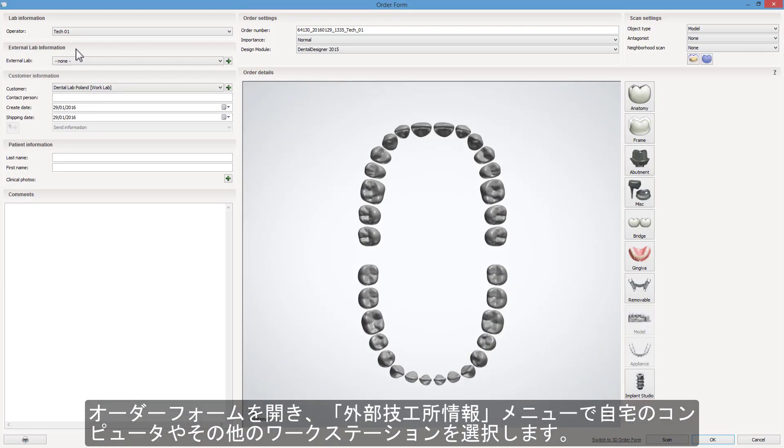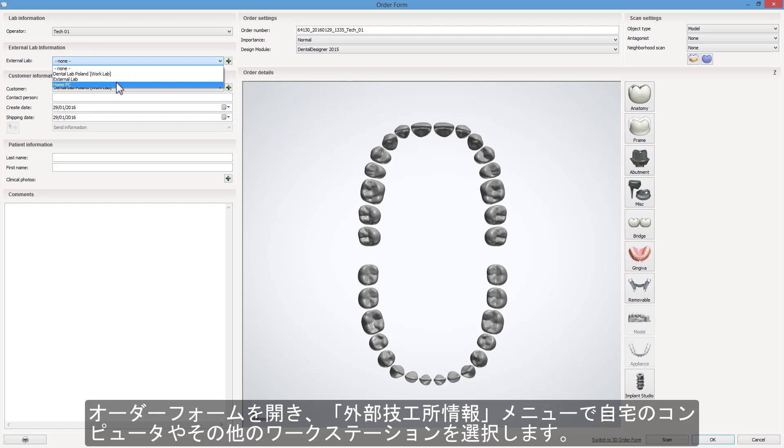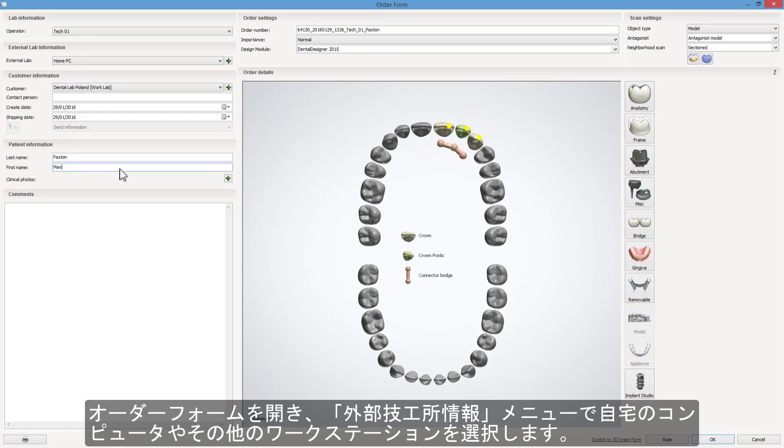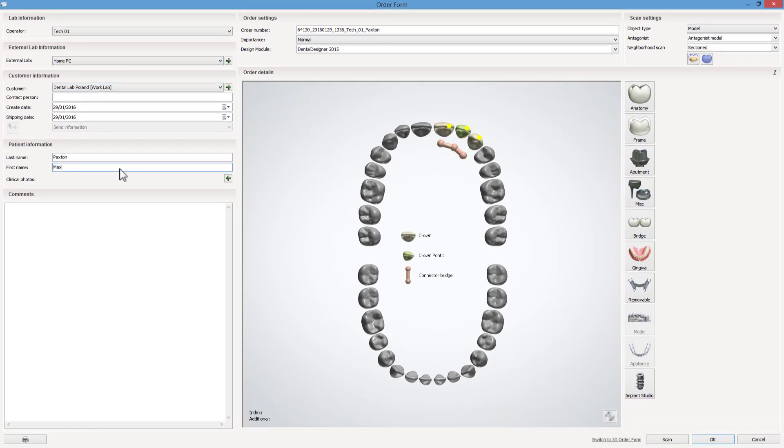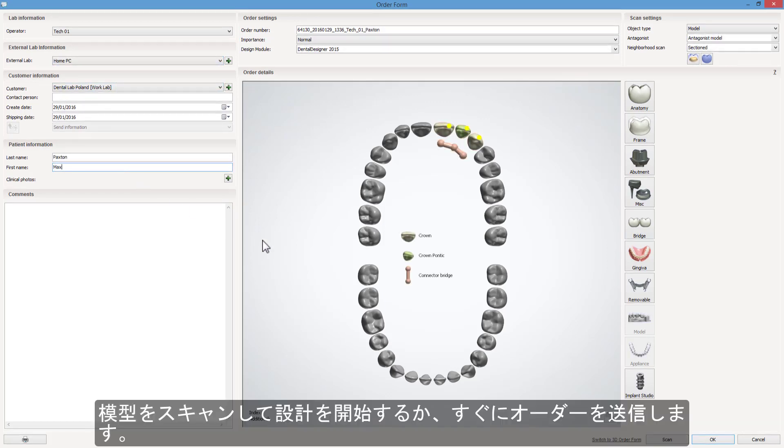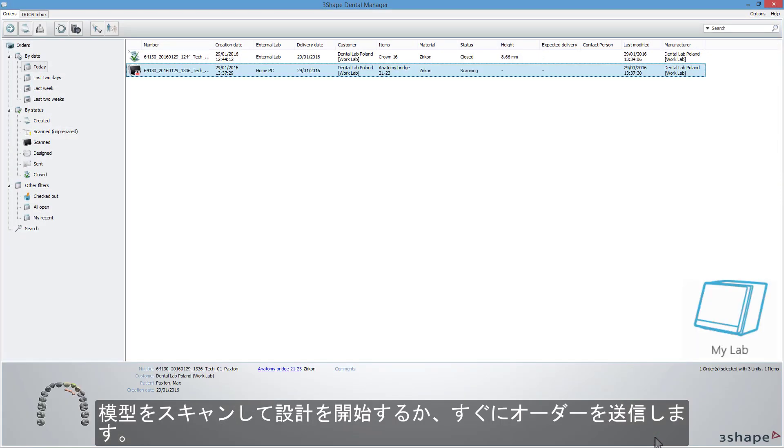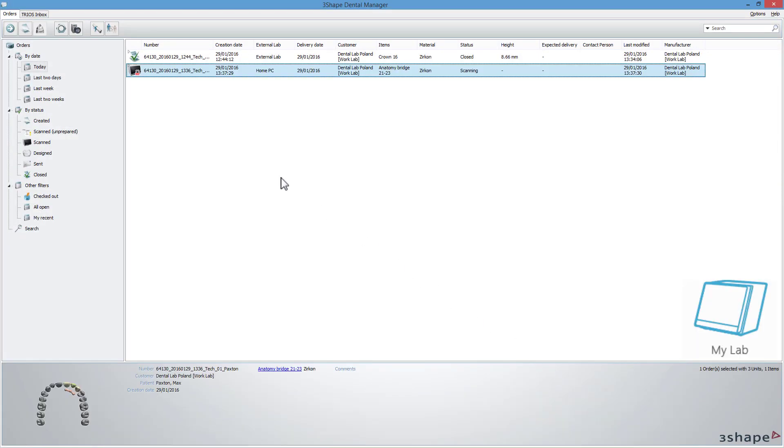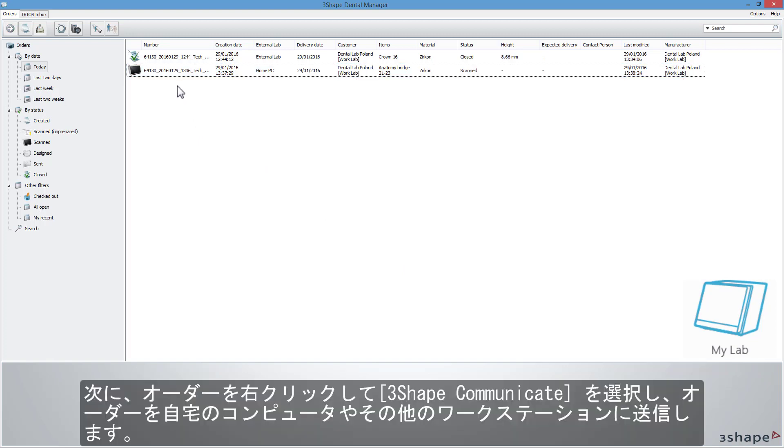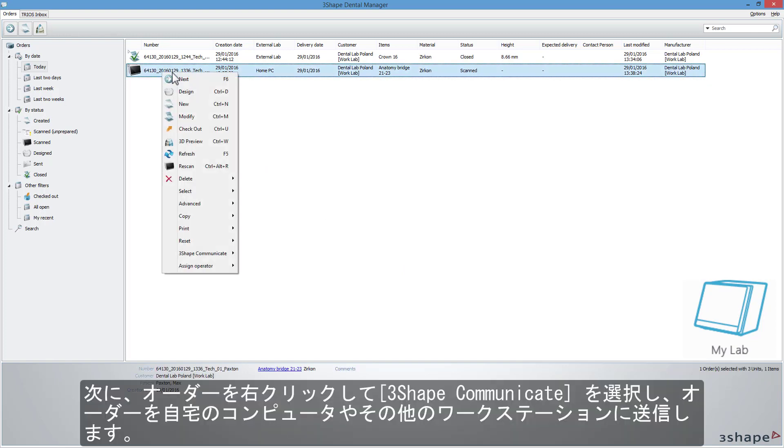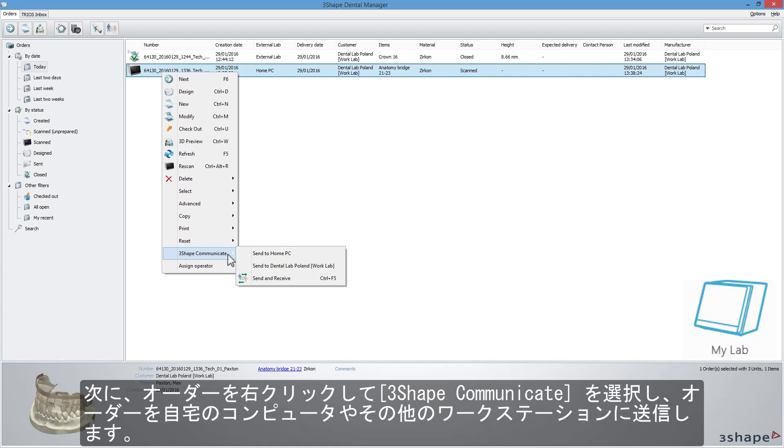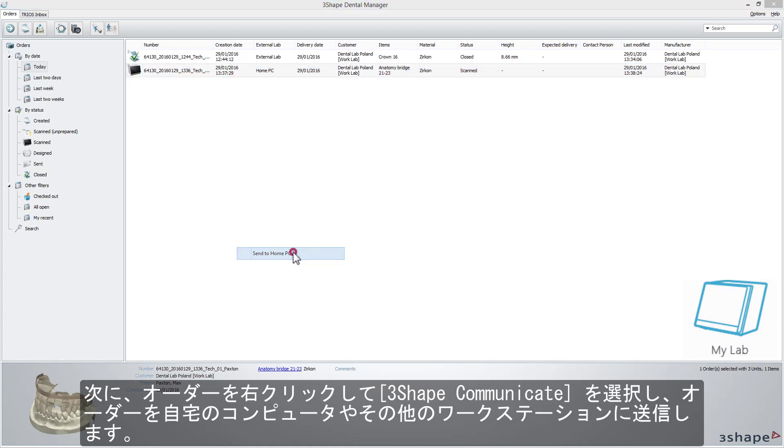Open the order form and now select your home PC or other workplace in the external lab information menu. Scan models and start the design or send the order straight away. To do so, right click the order, choose 3Shape Communicate and send the order to home PC or other workplace.